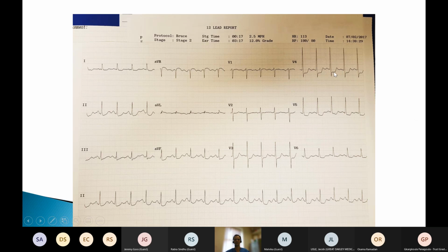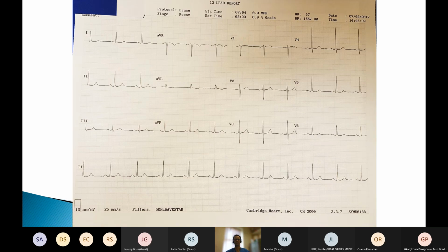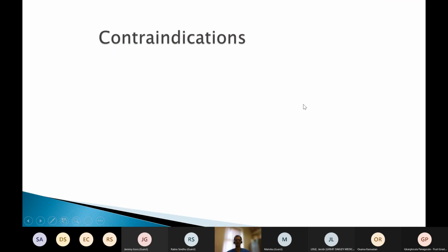Here, can you see this is horizontal. And fairly rapidly, the appearances resolve. So this is 1 minute into recovery. This is 7 minutes into recovery. The ECG's gone back to normal again. So that's a strongly positive exercise test. In stage 1, that patient needs a coronary angiogram and their heart looking at. And we know that from a study called the Courage trial. So it's an example of a really useful exercise test.